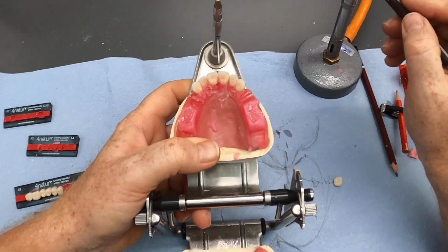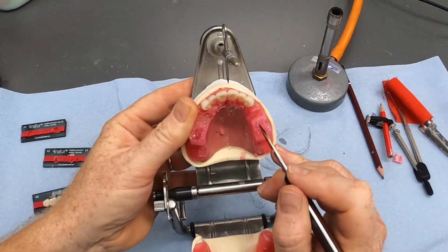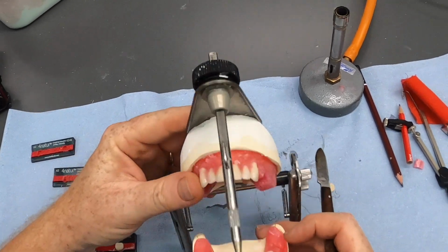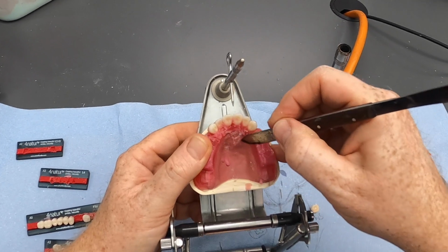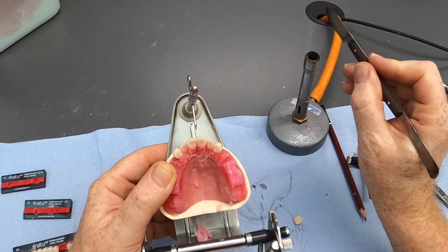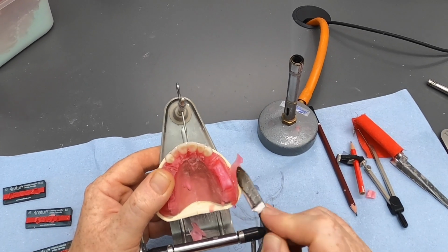So I'm going to remove some of this wax from the upper block because it's a bit hefty at the moment, and you can see where our palatal cusp needs to be, somewhere just here. Just by closing the models together you can see where the lower 6 central fossa is. It's about there, so that's where our palatal cusp is going to be. So I'm just going to reduce some of the material away from this block just to make it easier to position and move the teeth in the block. Same on this side, just take some of this material away.